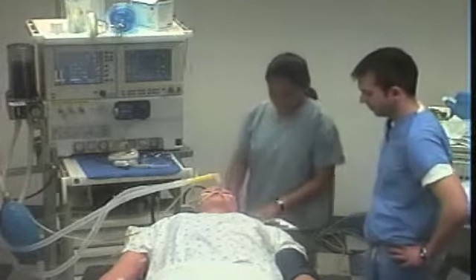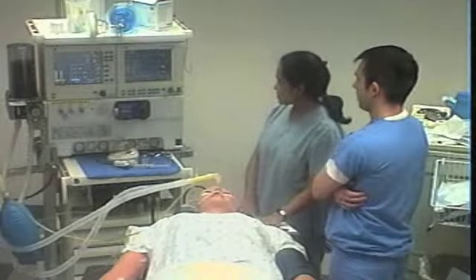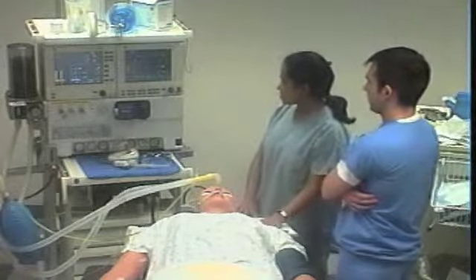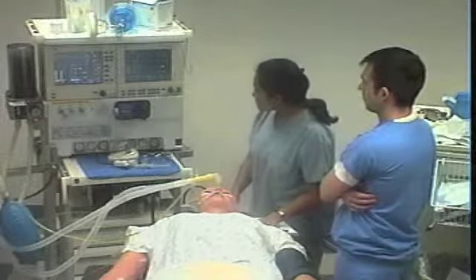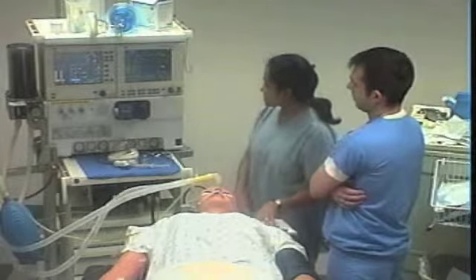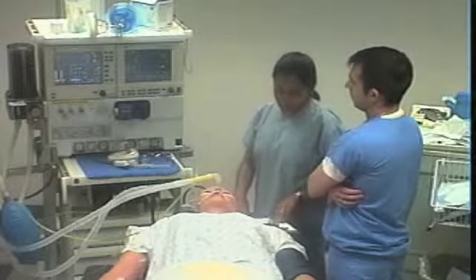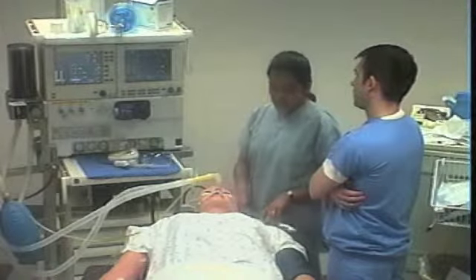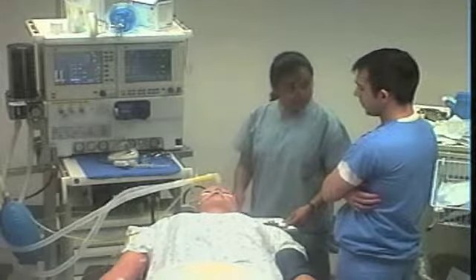Okay. And his vital signs, EKG monitor, he's running normal sinus rhythm, heart rate's in the 70s, blood pressure is normal, anywhere between 120s to 130s systolic and diastolic in the 50s and 60s. His ventilator settings: his tidal volume is 600 and his rate is 12. He has an I:E ratio of 1:2. His peak inspiratory pressure is anywhere between 15 to 20. And he's getting 2% of sevo. Okay. And his ET tube is taped at 24. All right. Anything else? No. Okay, thank you.